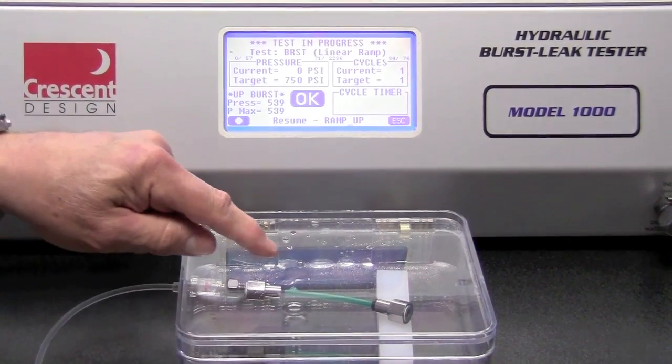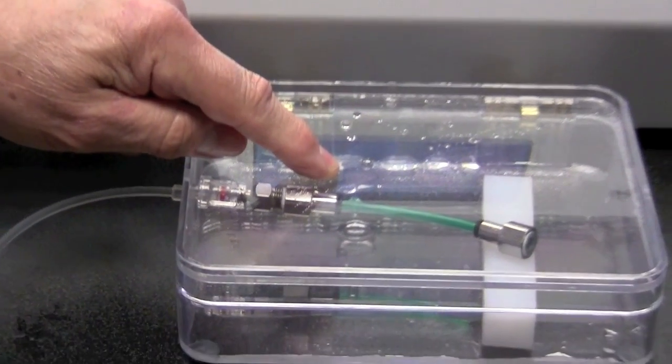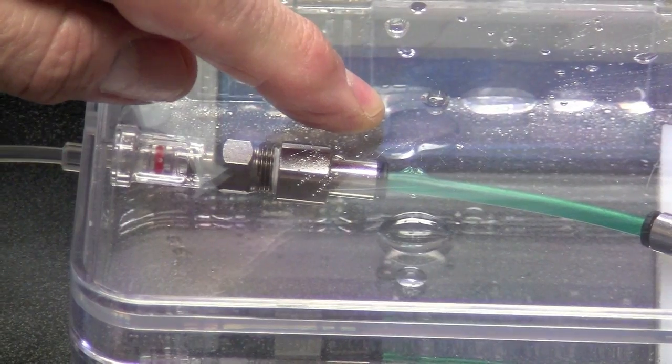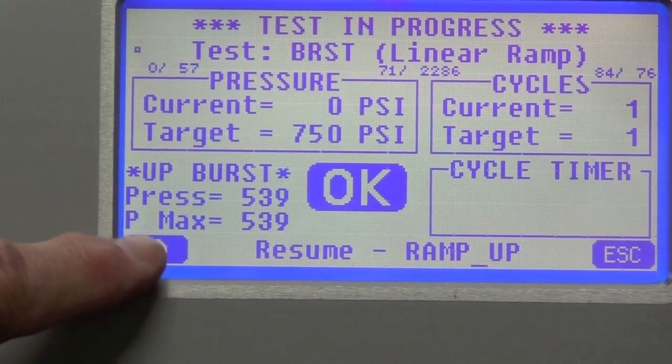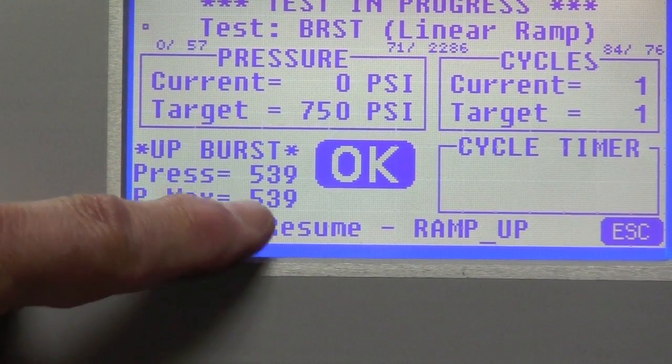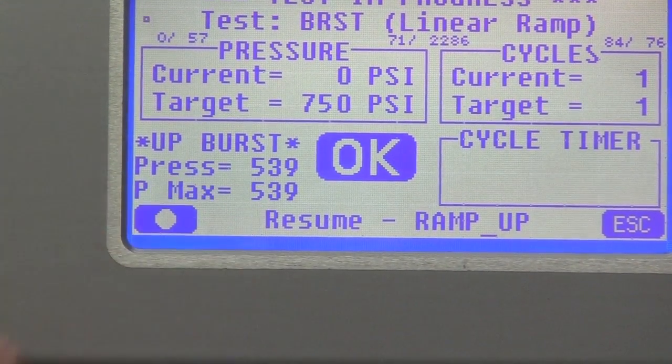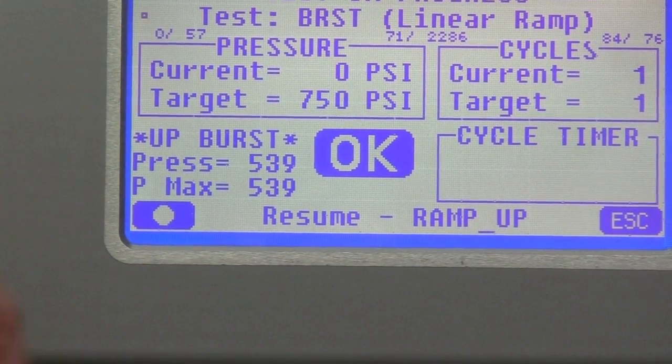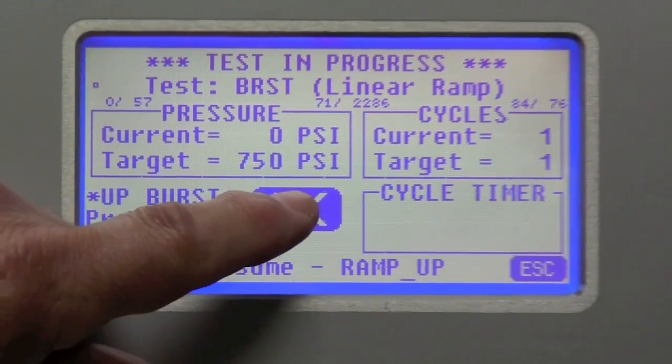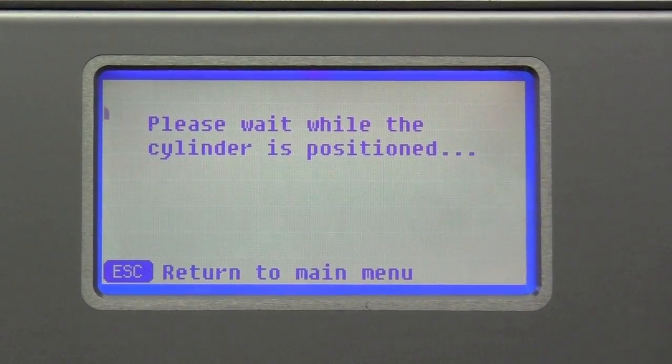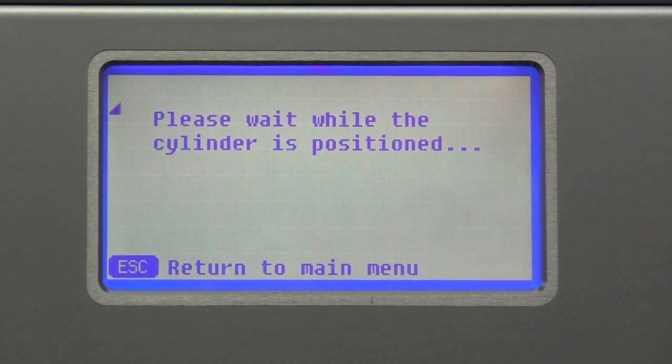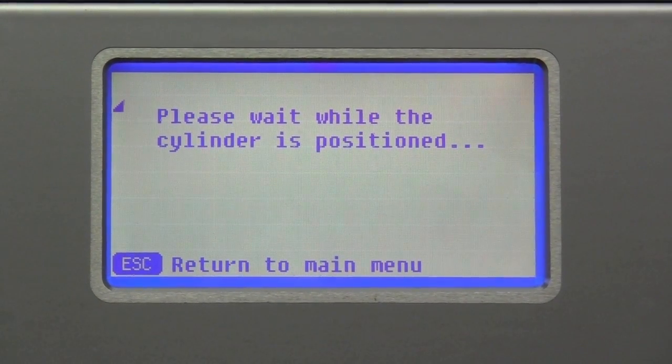So you notice that the tubing has ruptured at this end and the up burst pressure was 539 PSI. If I wanted to continue testing additional products, I would simply hit OK. And the machine will reset itself in anticipation of running another test.